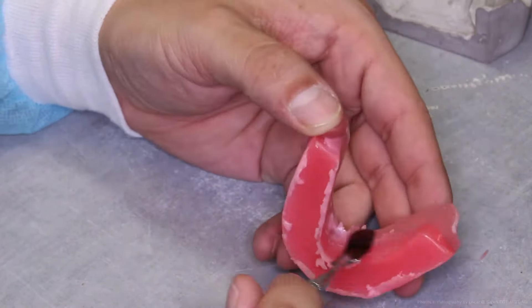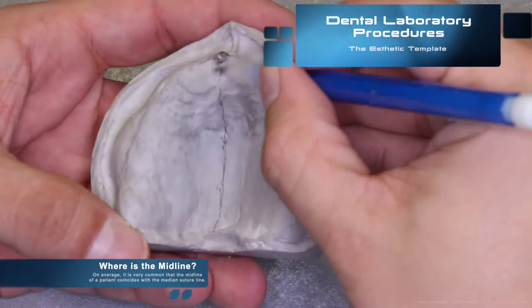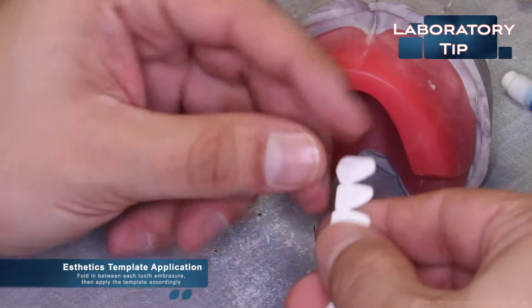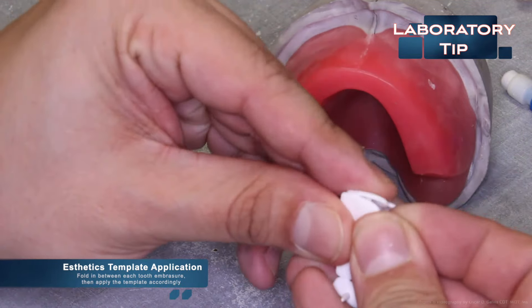There are certain things you can do to take the occlusion rim and record base fabrication further. First is declaring the midline — on average, the midline of a patient coincides with the median suture line. Designating the midline will aid in setting the two centrals, or using an aesthetic template as shown in this video. To apply the aesthetic template, fold in between each tooth and apply it to the template accordingly — the fold should be about at a 70 degree angle.